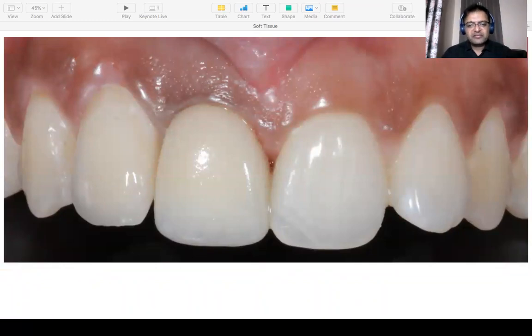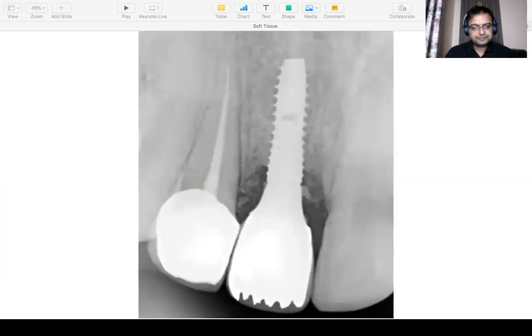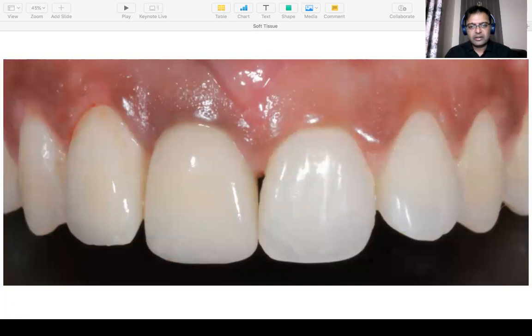Okay, and that's how this tooth looks when we fitted it. You see a very, very healthy stippling around the implant, and that's what I want. I want to see a nice stippling. It indicates that I have very healthy tissue there. And that's how it looks on the radiograph.